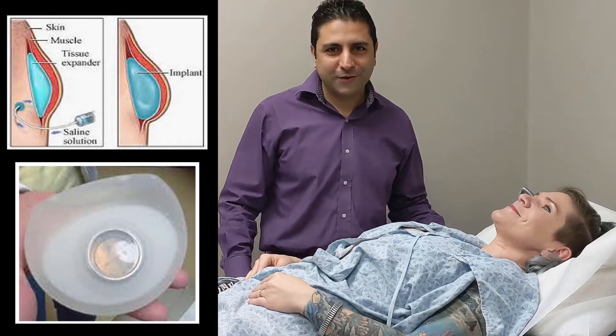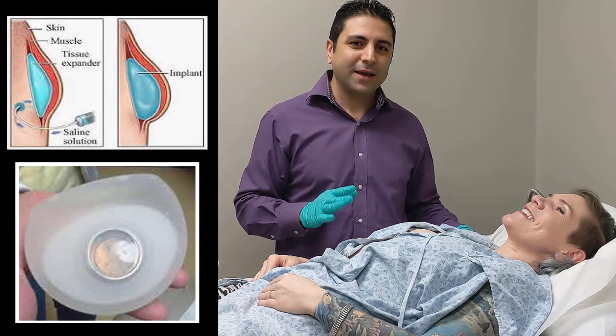Hi, I'm Dr. Davutti at Northeast Georgia Plastic Surgery. I'm here with one of my wonderful patients. She's had breast reconstruction with expanders in place.